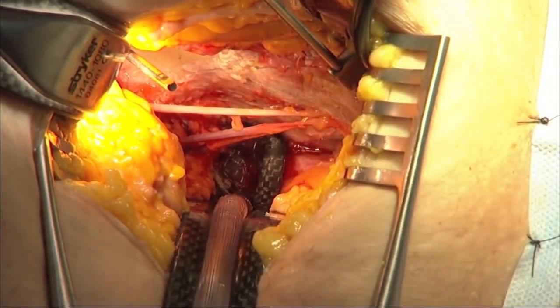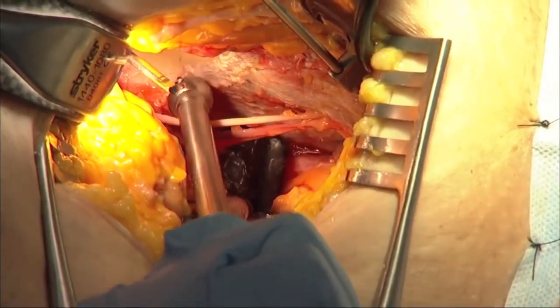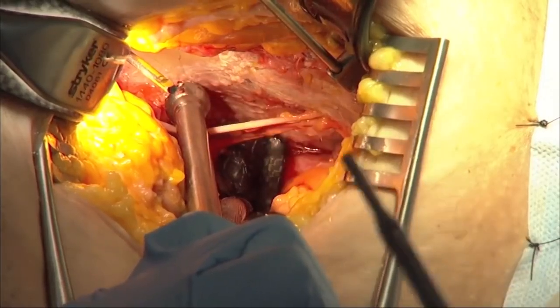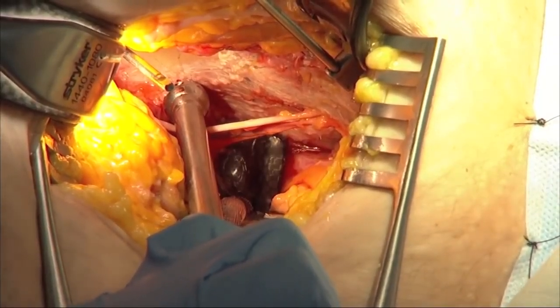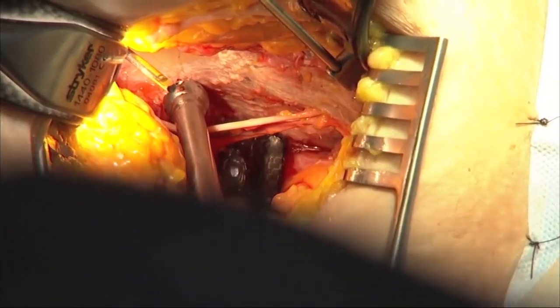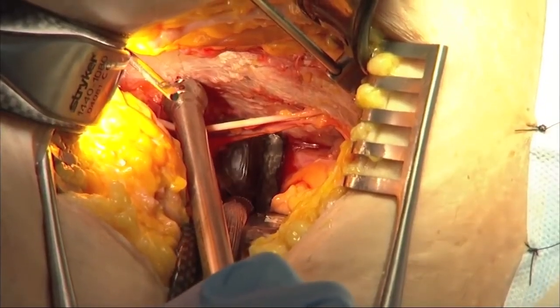Next, I'd just like to show you the spiked screw inserter in action. Again, you can work either above or below the nerve, but this is a frequent area where we need to put a lag screw. We've got pelvic viscera and nerves in the way that we need to protect, and we don't want to wrap those up with the drill bit and injure them. So the spiked screw inserter is nice because we can drill through it, protecting the nerves and the pelvic viscera.